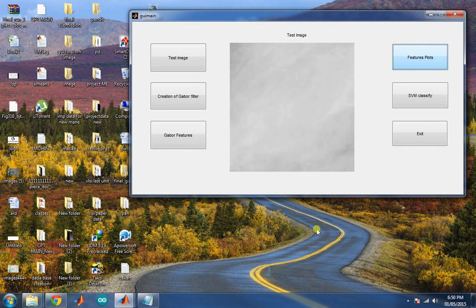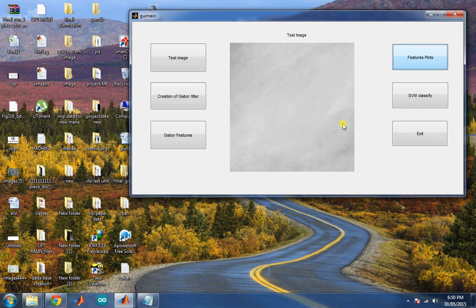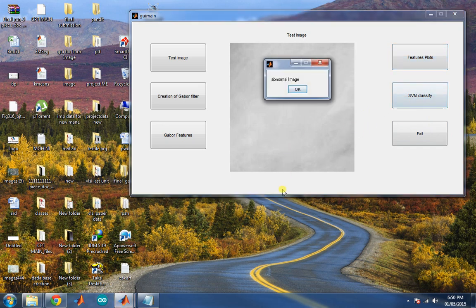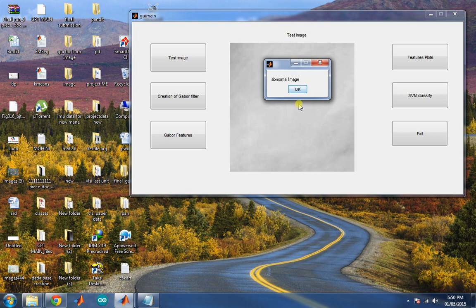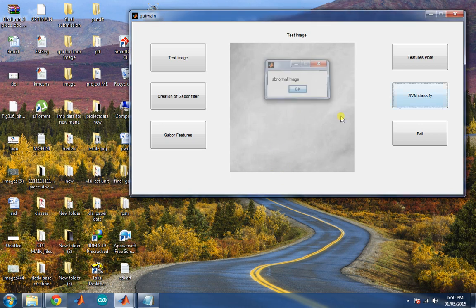Provide this input to the SVM classifier to verify whether the image has cancer or not. So the final result is abnormal image, that means the image contains cancer.